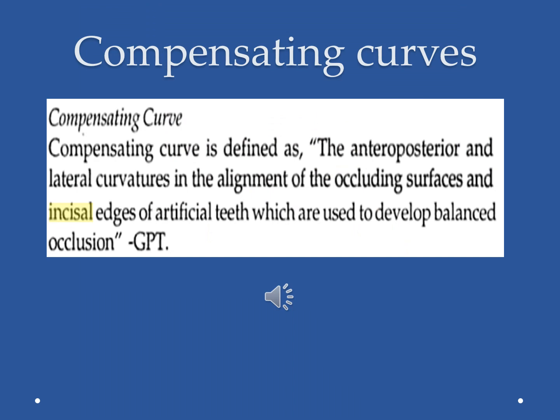Do you remember the compensating curves, which we said will originate after setting of upper posterior teeth, after following the setting rules? So the compensating curve is defined as the anterior posterior and mediolateral curves in the alignment of the occluding surfaces and incisal edges of artificial teeth, which are used to develop balanced occlusion.